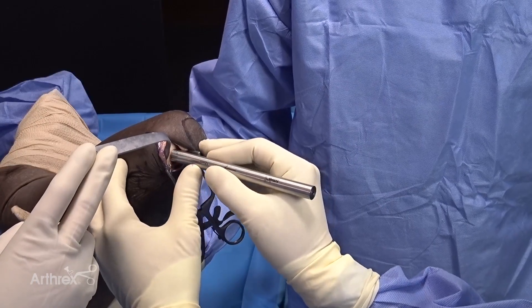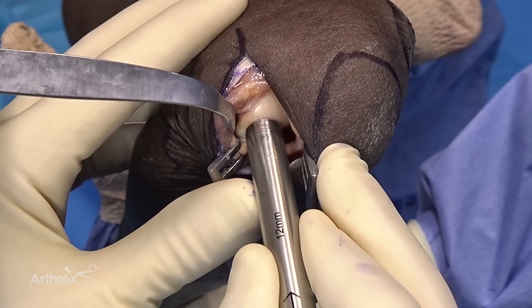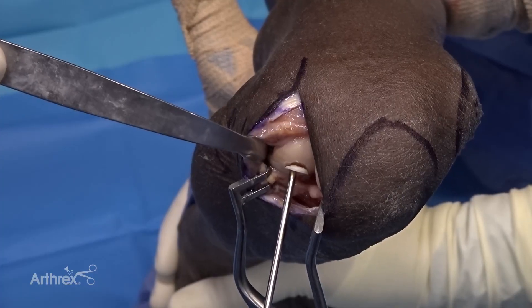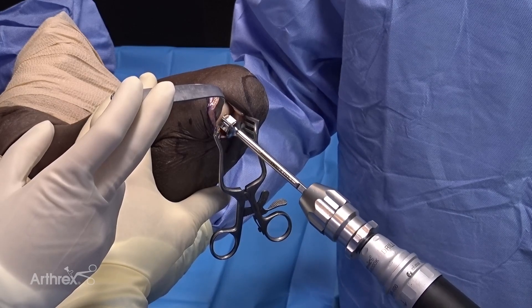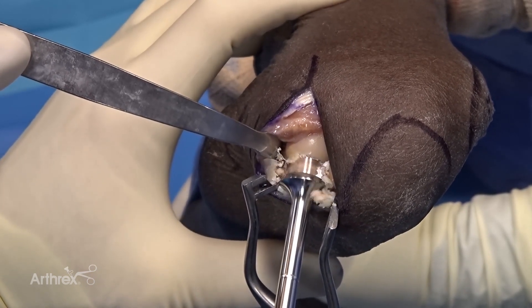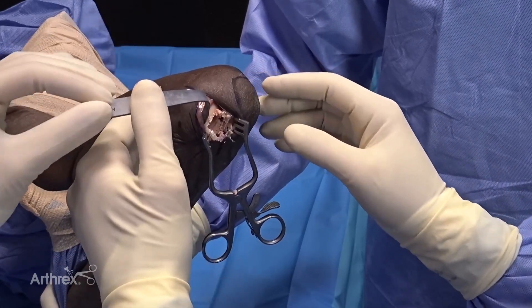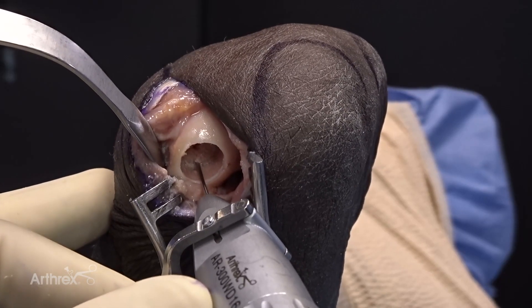While holding the 12 millimeter alignment rod perfectly flush to the articular surface of the capitellum, my assistant will next insert the 2.4 millimeter guide pin. With the guide pin in place we'll proceed with recipient site preparation. Next we'll ream the recipient site using the 8 millimeter deep, 12 millimeter diameter single-use OATS reamer. The guide pin can then be removed, and we'll lavage the recipient site to remove the preparation reamings from the field. To improve biology and aid in graft incorporation, it's helpful to use a small wire to drill the base of the recipient site.